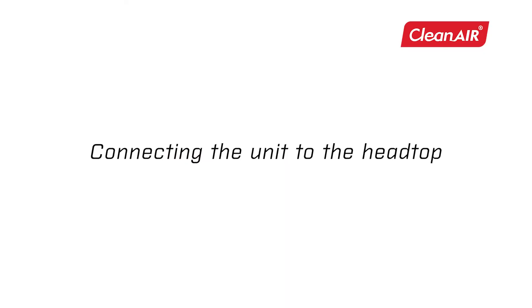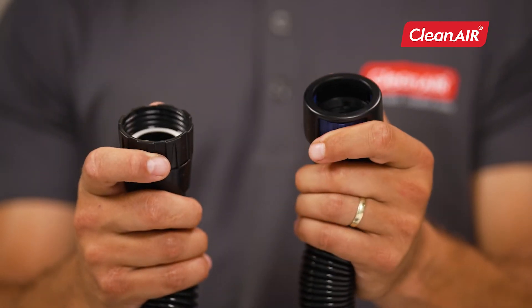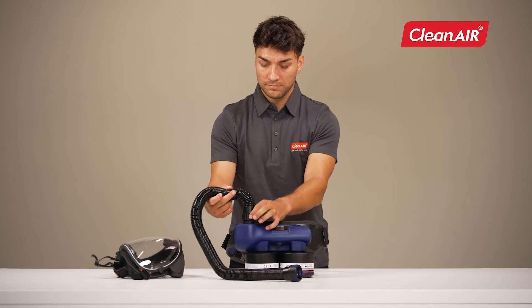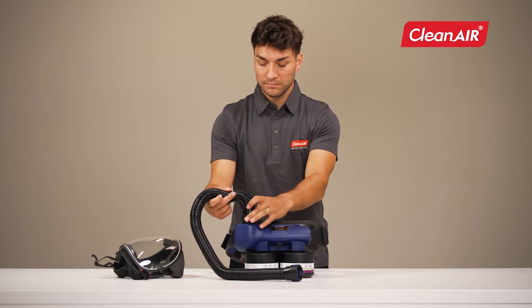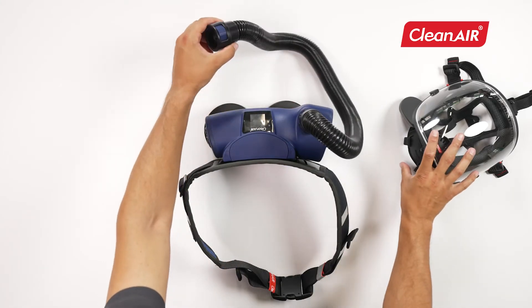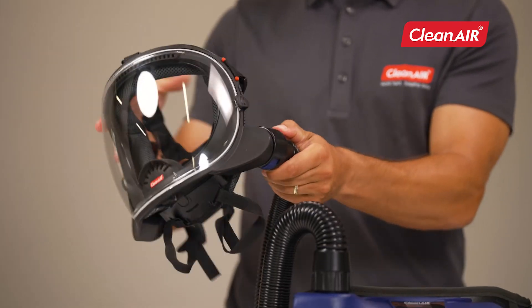Connecting the unit to the head top. Connect the hose using the thread on one side of the hose. Connect the other side of the hose with the quick lock connector by clicking on the head top.